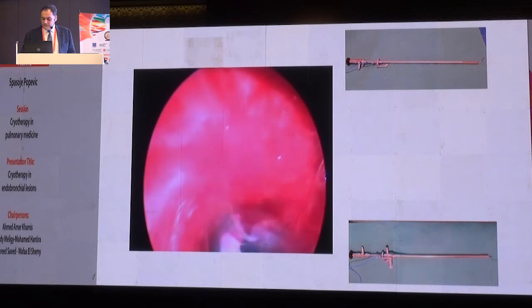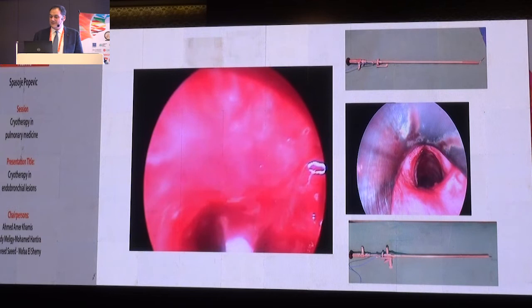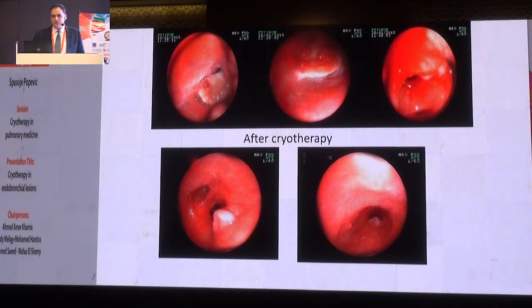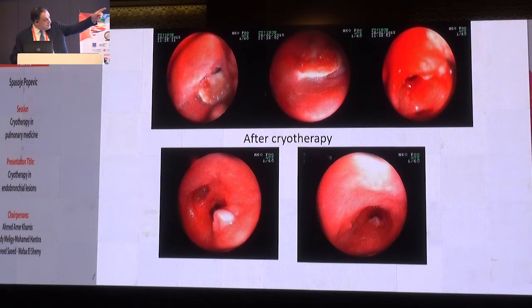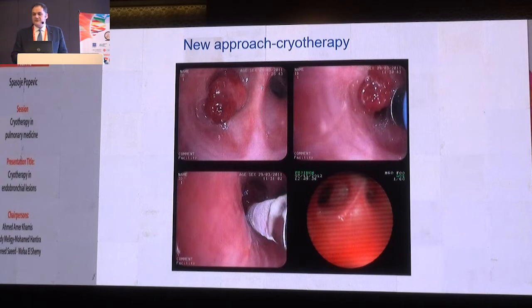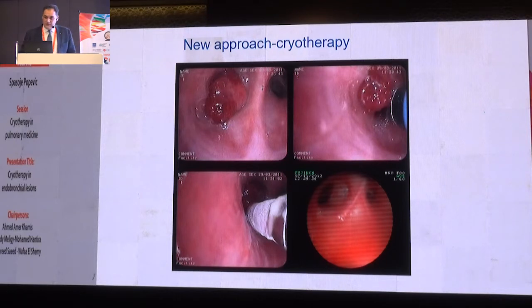One patch after another, and the result was like that — six months after therapy with inhaled corticosteroid treatment. After removal of foreign bodies, granulations sometimes occur, which you can treat safely and effectively by cryotherapy. The third picture shows immediately after foreign body removal, and after cryotherapy the picture looks much better. If fresh granulations progress to fibrotic stenosis, there would be no help for the patient. This is also a treatment of endobronchial tuberculosis — the tumorous form combined with anti-tuberculotic drugs and cryotherapy — the effect was good. Bronchial tuberculosis form is very prone to relapsing and can be treated well with cryotherapy.